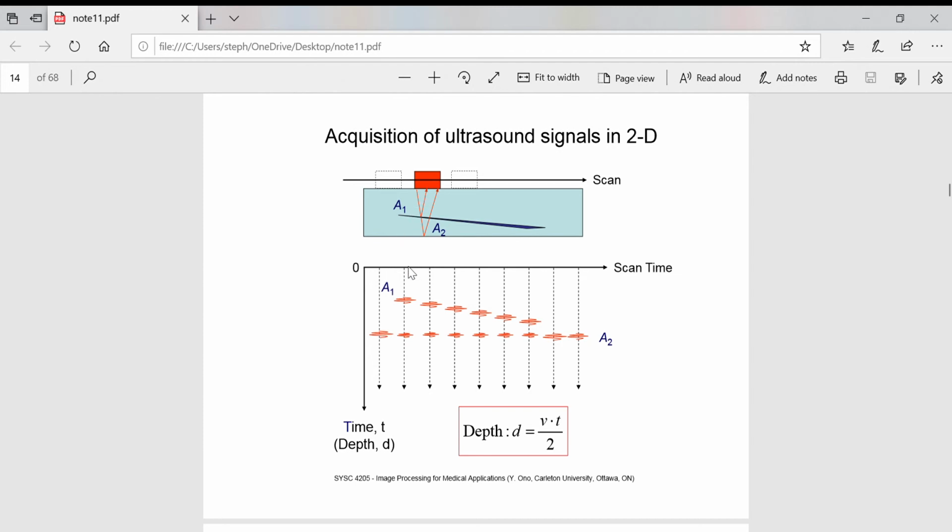Here, if we move the transducer and it starts to come into contact with this object that's within our larger object, it's going to reflect back. So it's going to have an echo train here, right? This particular signal that's coming back sooner, and usually at a much higher amplitude, is going to be closer to the receiver than this one will be.